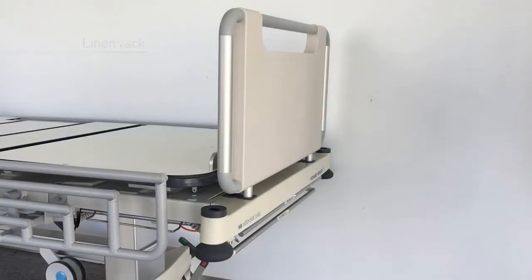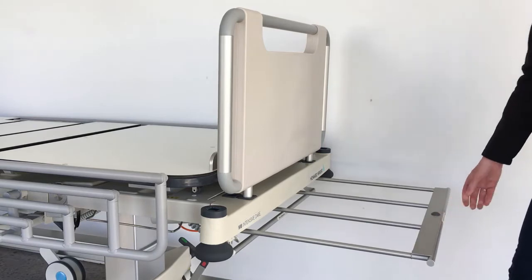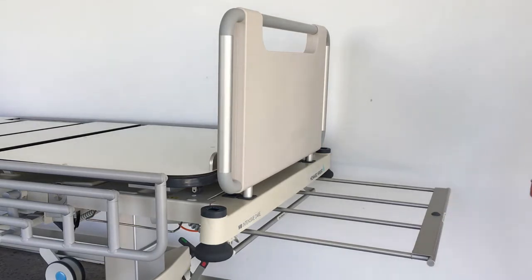A linen rack is located at the foot end of the bed and can be used for storing clean linen. To extend the linen rack, simply pull out the tray. To stow it, push the tray back in.